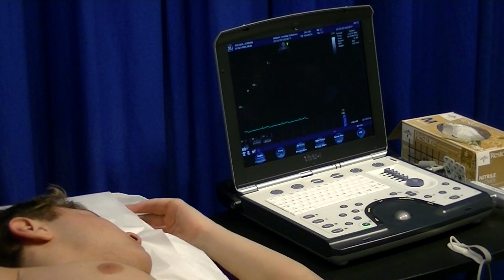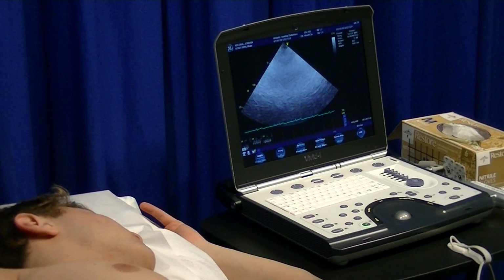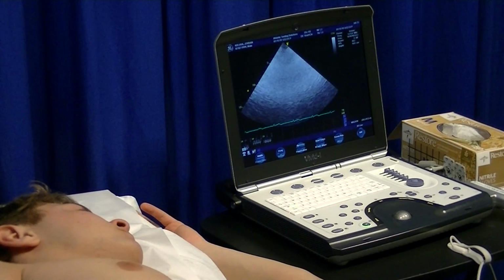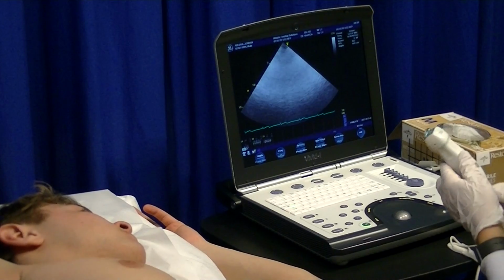If you see any evidence of a hypertrophic heart, so if your LVOT velocity looks like there is any dagger shape or you're seeing any wall thickening in there, it would be good to obtain a continuous wave of the aortic valve with Valsalva maneuver, just to see if that velocity increases. You could also obtain M mode of aortic valve to see if there's any early valve closure. In your mitral valves, you can look for mitral valve prolapse if you're seeing mitral regurgitation.